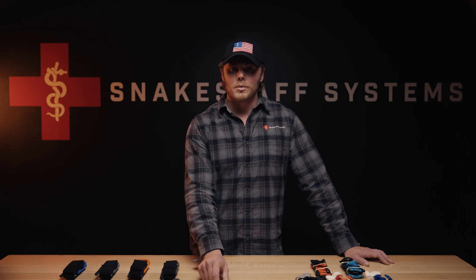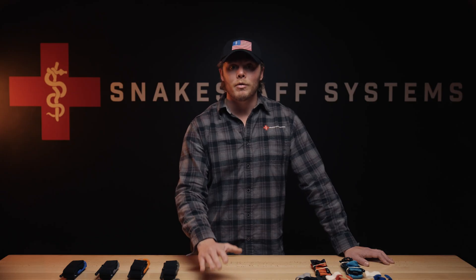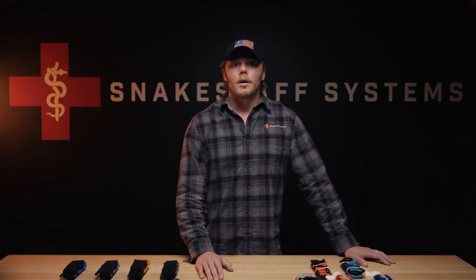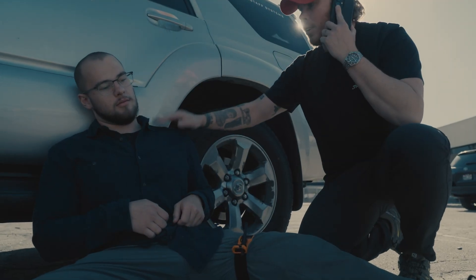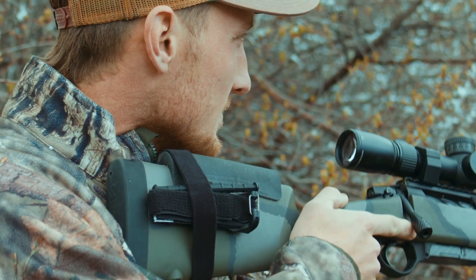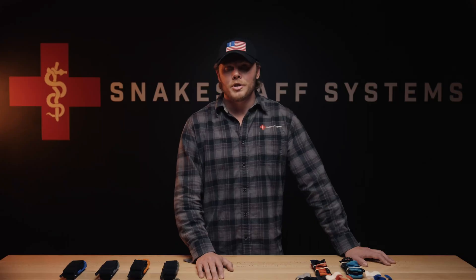A tourniquet stops blood, and with it, oxygen. The longer it stays on, the more tissue you risk losing. Narrower bands concentrate pressure into nerves and muscle. Wider bands spread it out, buying time and comfort if evacuation takes hours. In an urban environment where help is minutes away and time to definitive care is typically less than an hour, a compact one-inch ETQ makes sense. In remote or tactical environments, a wide variant gives you margin. Match your gear to your environment.